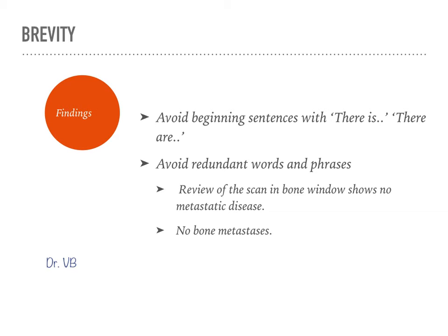Words and phrases which do not contribute any information to the report, like "review of the scan in bone window shows no metastatic disease." Rather than that, you can simply say there is no bone metastasis. It is understood that you had reviewed the images in a bone window.